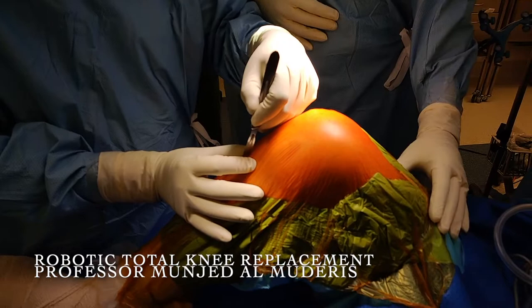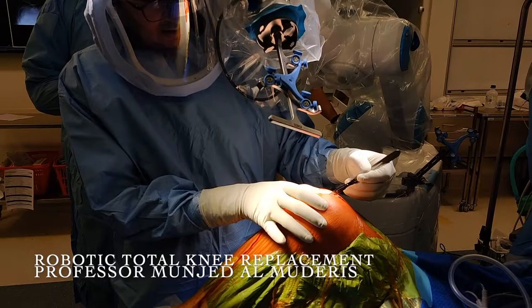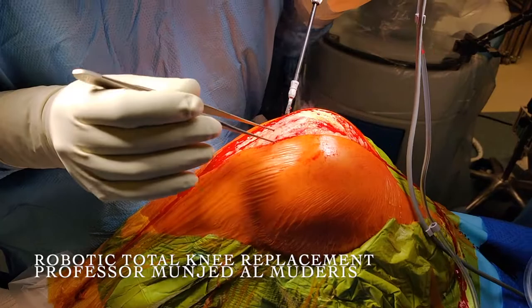We start with a midline incision. I do not use a tourniquet. I dissect the soft tissue while the robot is calibrating its position. Once the computer calibrates its position, we remove the calibration arm and replace it with the cutting arm.